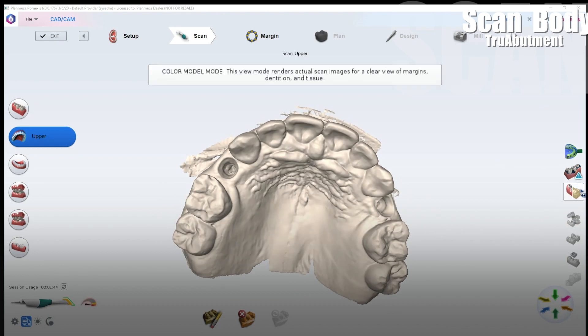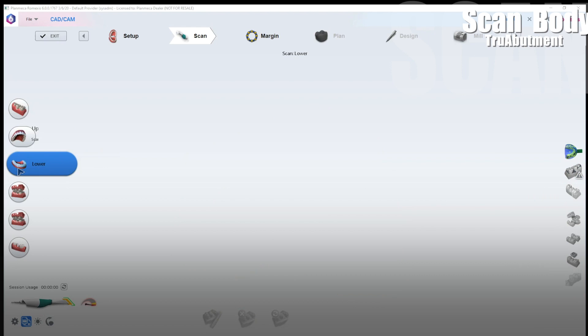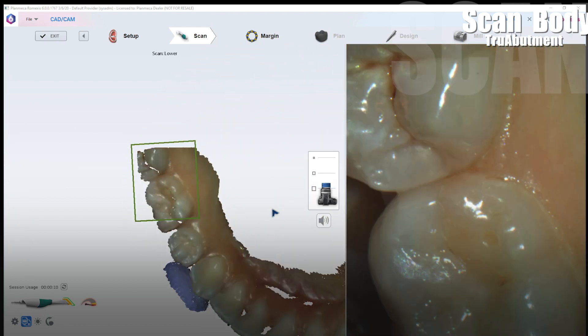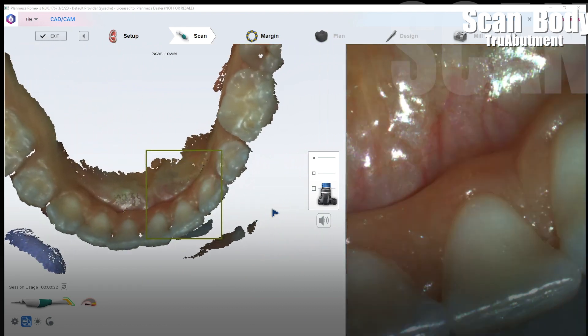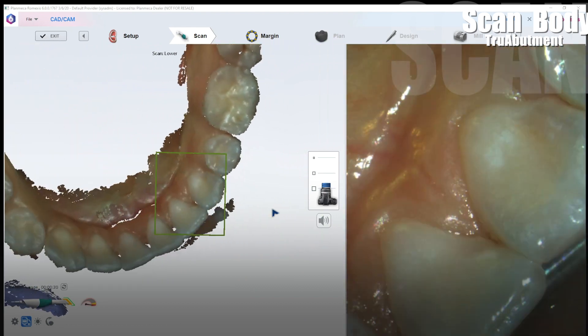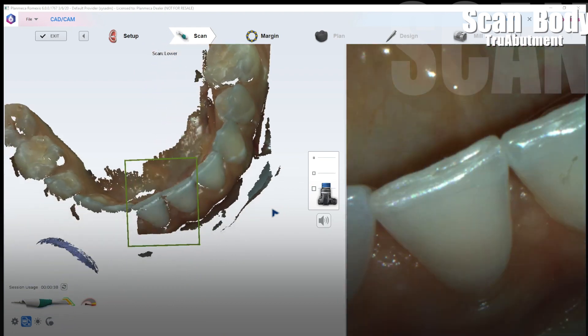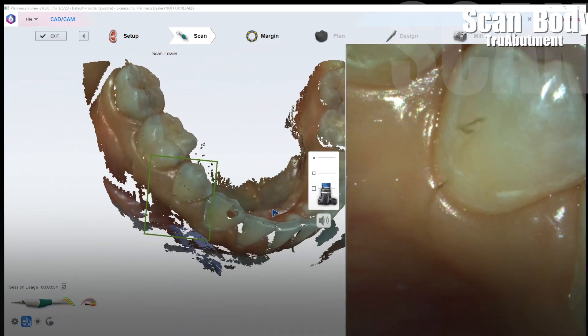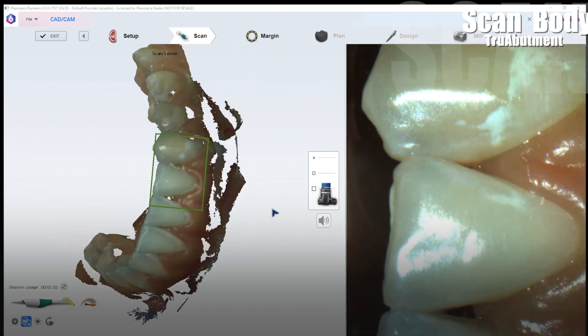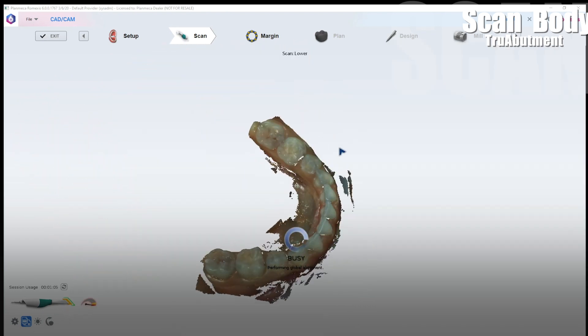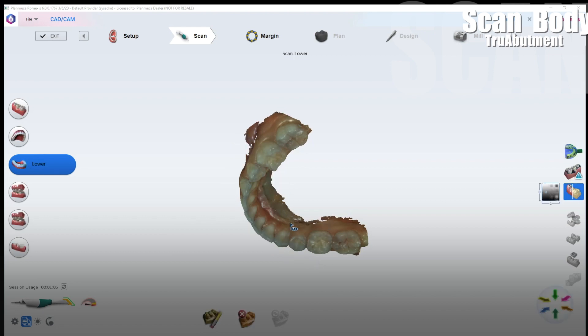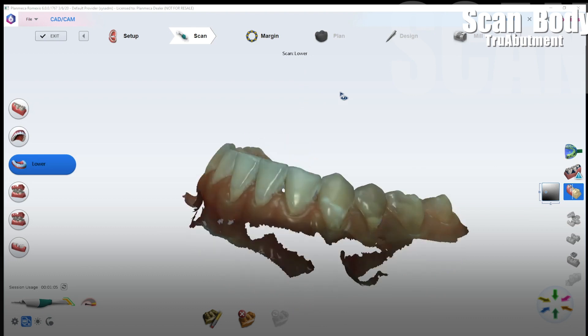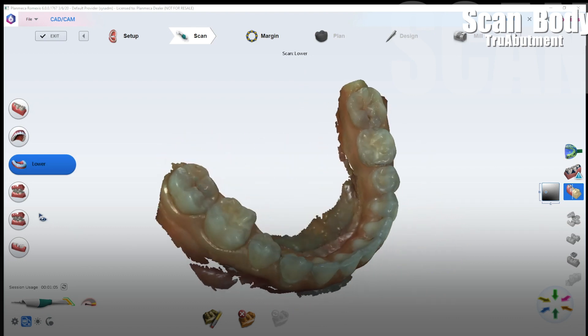So now what we're going to do is we're going to scan the opposing. I'm just going to go ahead and speed this up. I like to capture the linguals and then kind of a buccal 45 degree view and then fill in all the data. There we go. The opposing doesn't have to be absolutely perfect. The software does a good job at rendering the soft tissue away and making the model look beautiful.